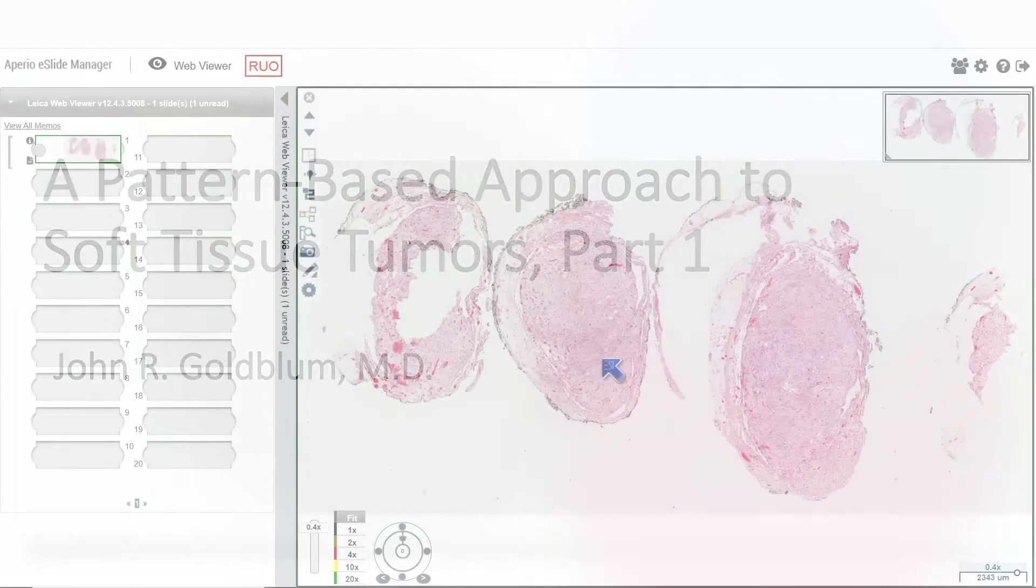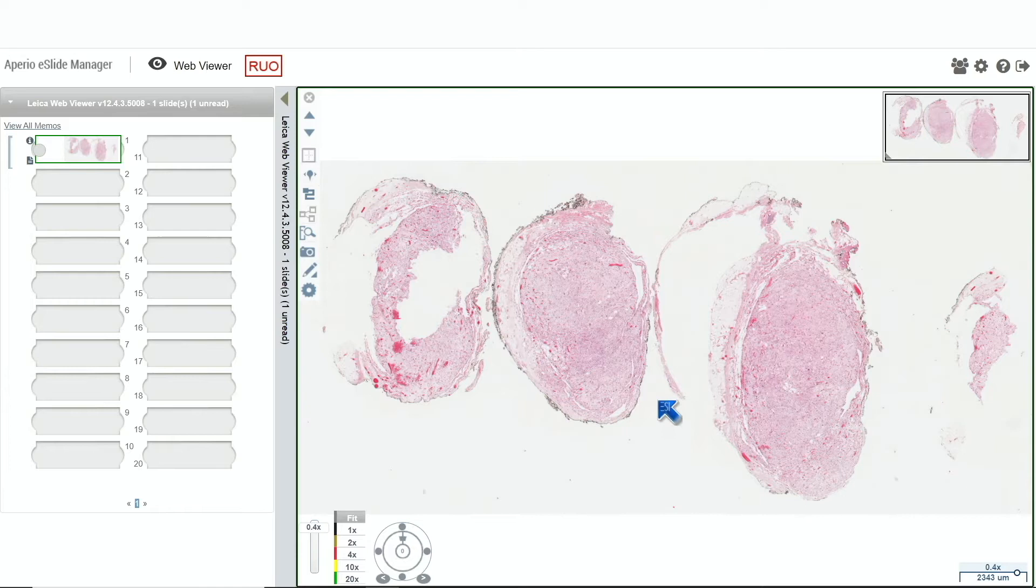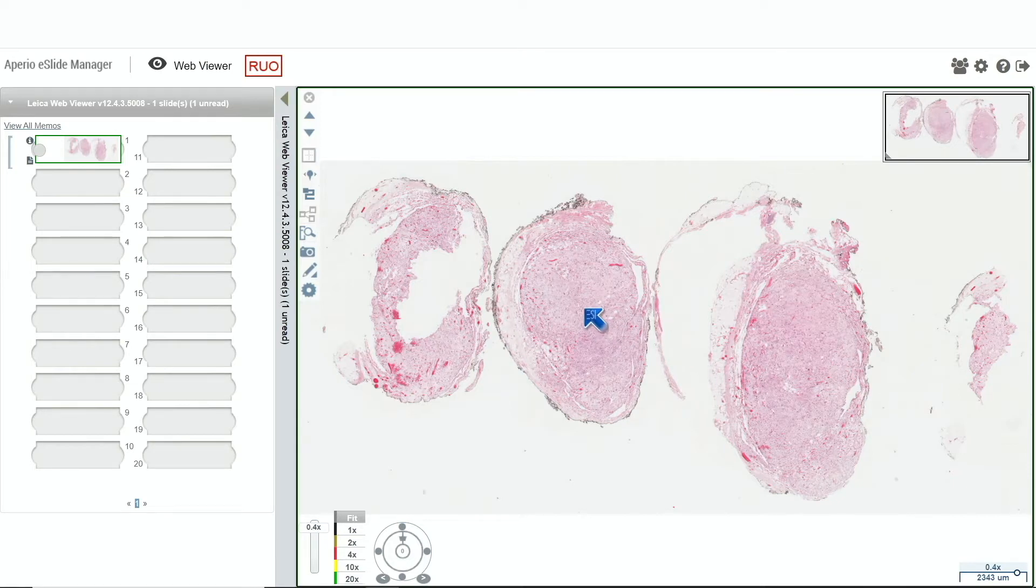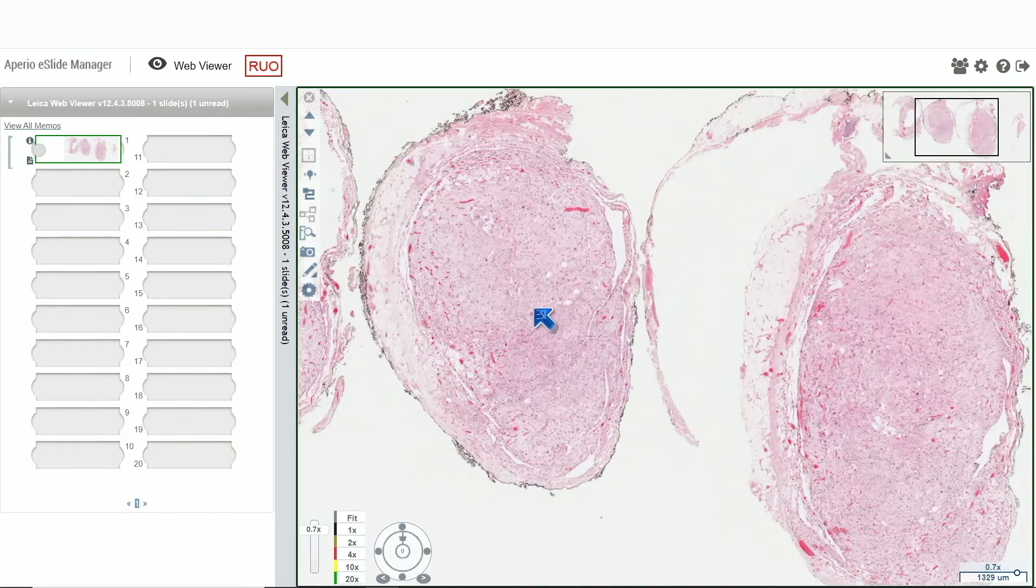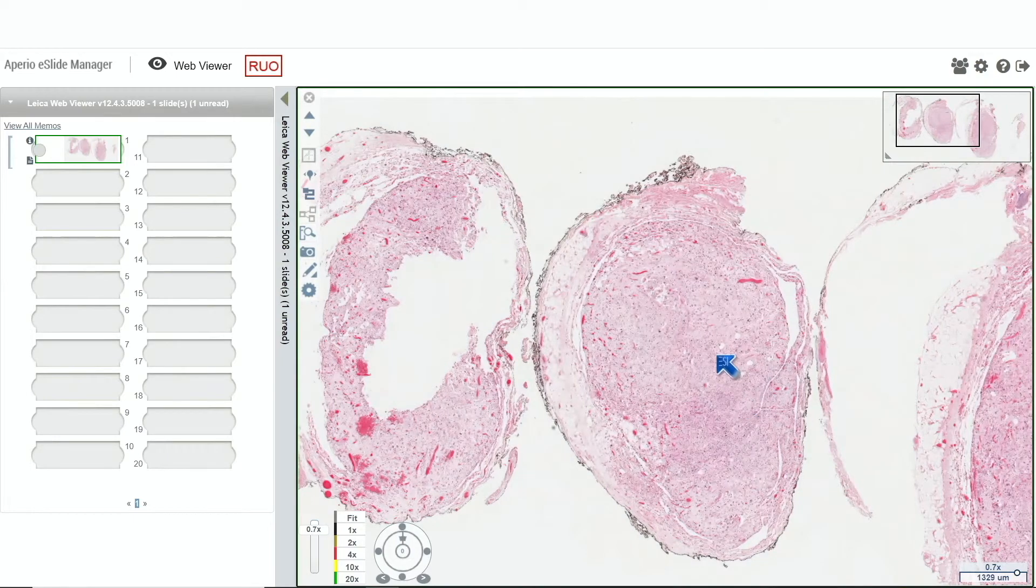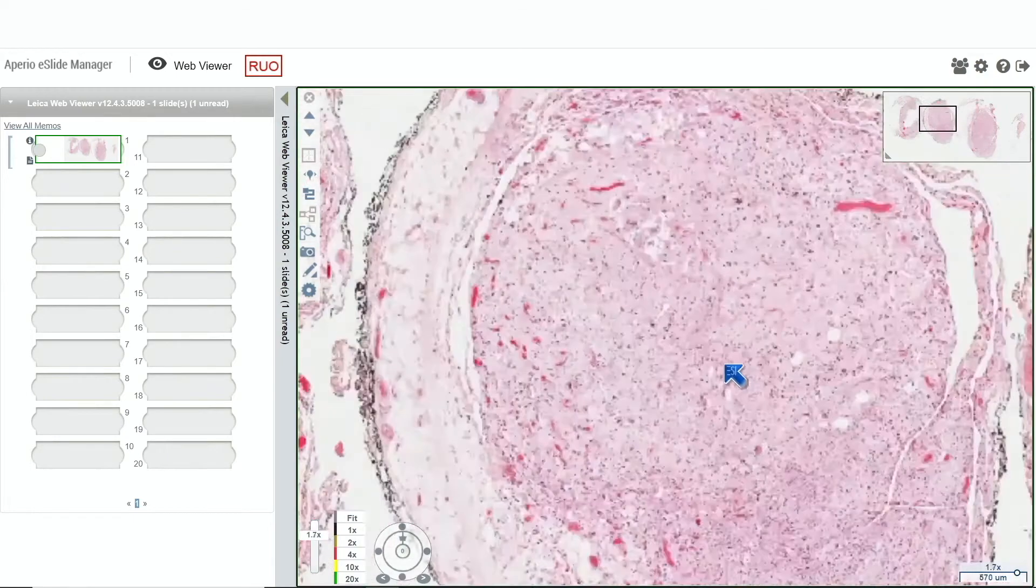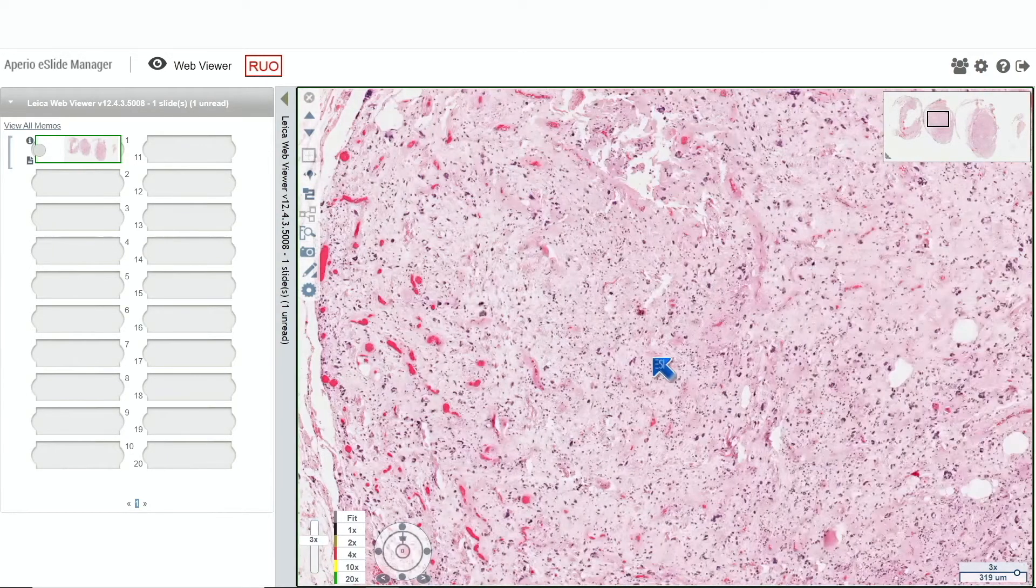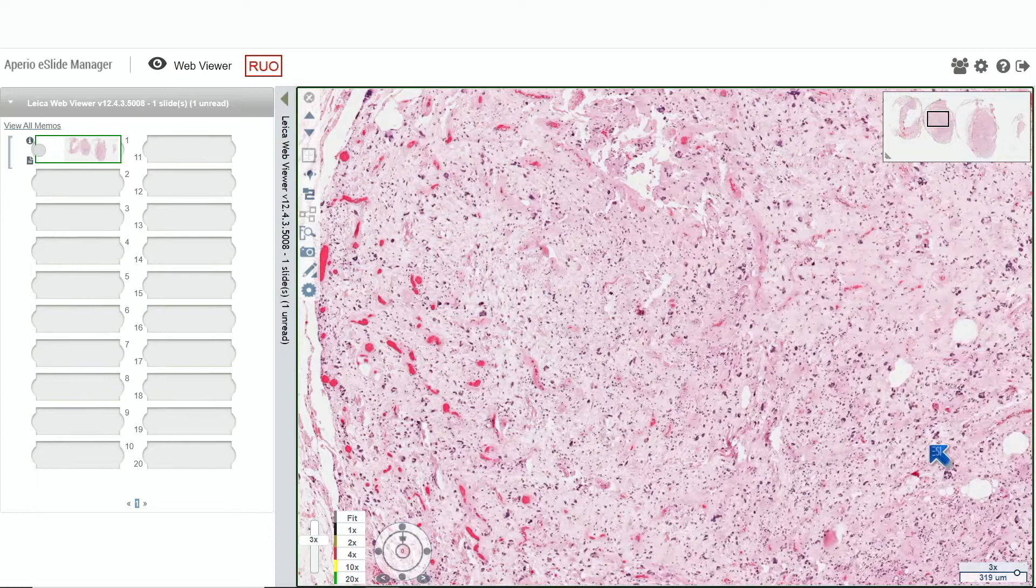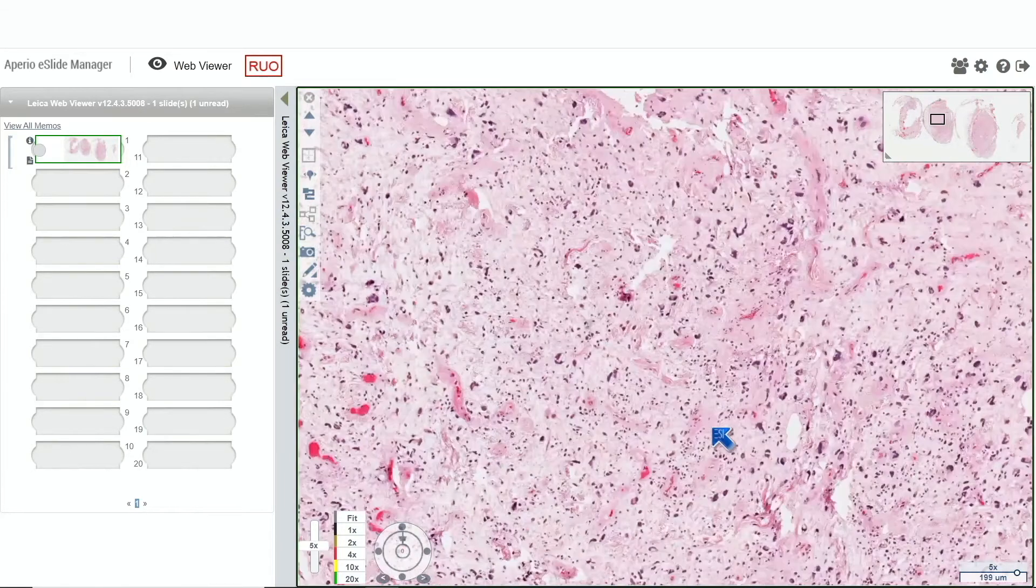Take a look at this well-circumscribed lesion. It's a little bit hard at low power to say this is a fatty tumor because I actually don't see any fat. Well, here's maybe a few adipocytes. Let's take a look. This is much more myxoid than the lesion that we showed.